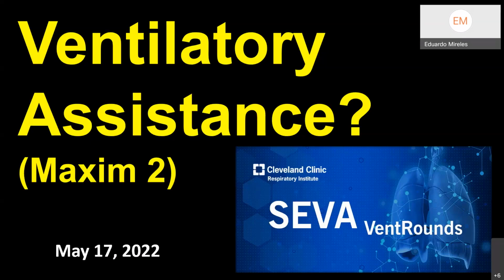And I thought that we would go through the 10 maxims in the next SEVA VentRounds just to strengthen the knowledge of the team and do a little snippet at the beginning, and then we'll go on theory, and then we'll do several cases that exemplify the maxim. And we have with us Rob Chatburn and myself as co-hosts of SEVA VentRounds.